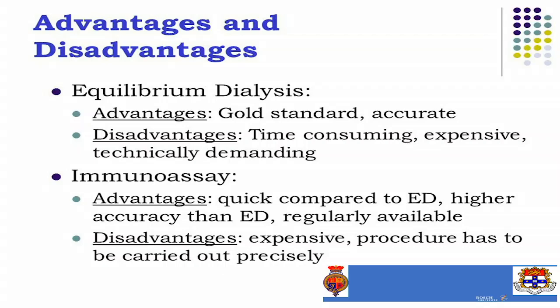Paul, very provocative and fantastic, thank you. I think it really comes down to outcomes. You did a wonderful job summarizing all of the analytical chemistry that we bash our head against the wall with every day. But really, at the end of the day, we're just measuring a different biomarker in each assay. Which biomarker predicts the outcome in a meaningful way clinically? Should we be going back to the RIA, for instance?